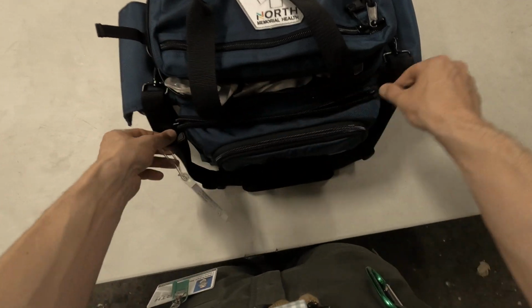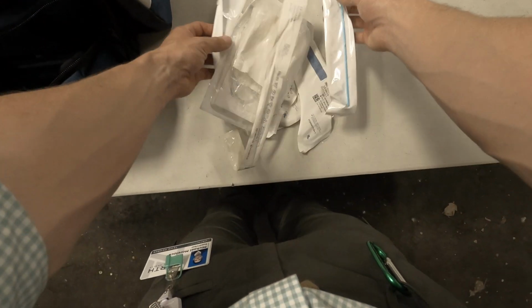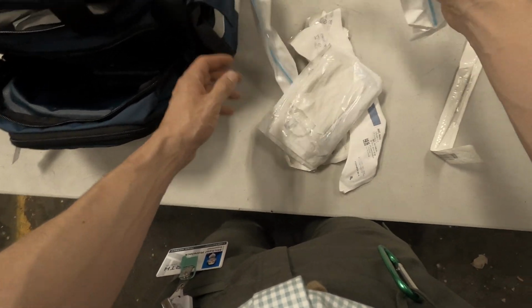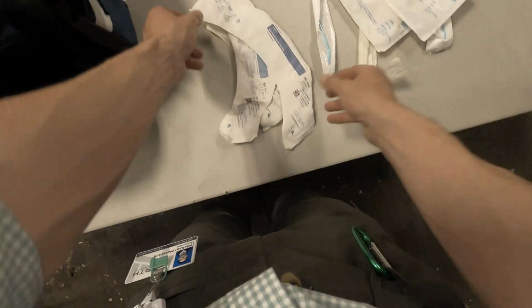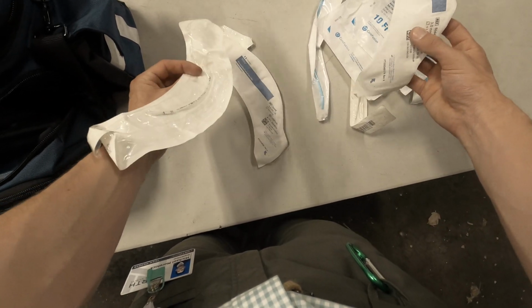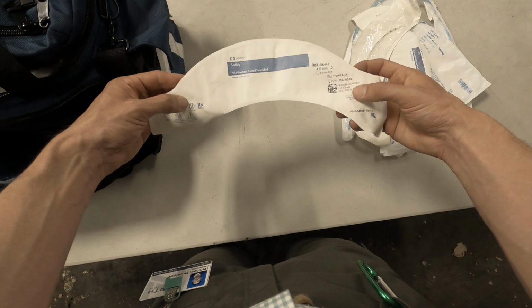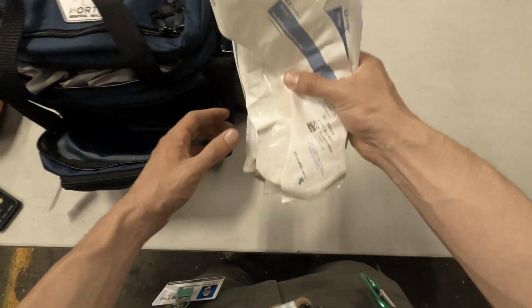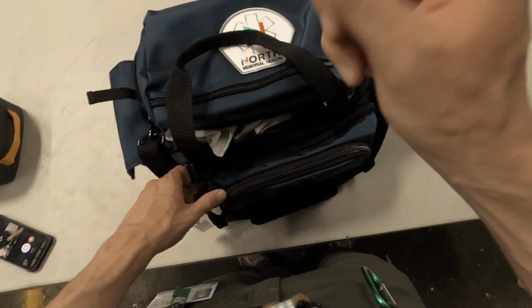So the last pocket that has anything is this front pocket. This is the PEDS tube pocket. We have a PEDS stylet, PEDS bougie or flex guide. There are a couple suction catheters, smaller ones, a 3.0 mil endotracheal tube, a 2.5 mil endotracheal tube, and a 4.0 millimeter endotracheal tube. Now currently our medical direction and quality assurance is only letting Metro Critical Care change tubes.